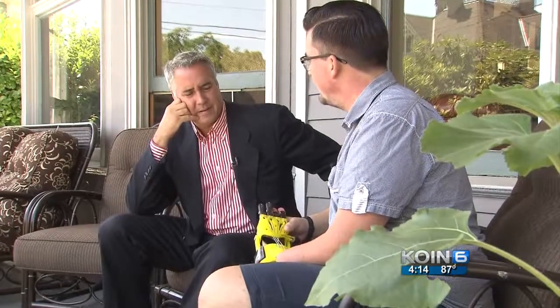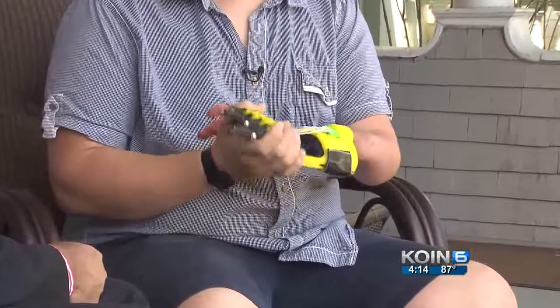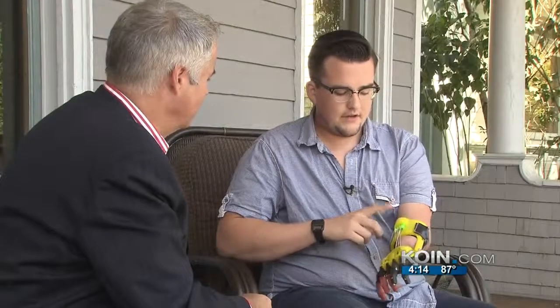The idea for the hand is revolutionary enough, but the way it's made is something that wasn't even imaginable several years ago. The yellow plastic and carbon fiber fingers have all been made with 3D printers. It works a lot like a hot glue gun — filament goes through the top, down the extruder, sits on a plate, and builds up layer by layer.